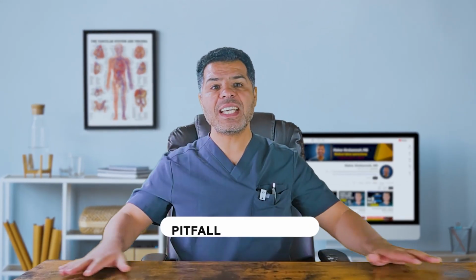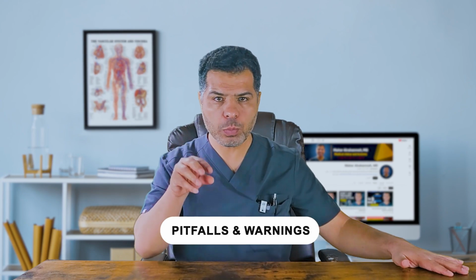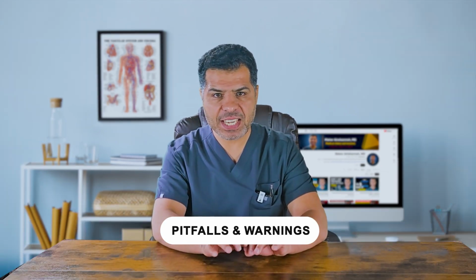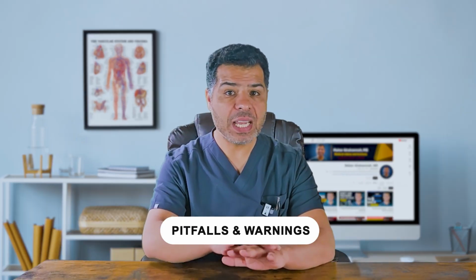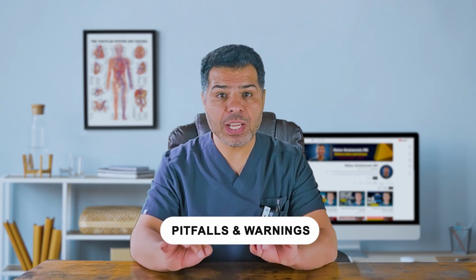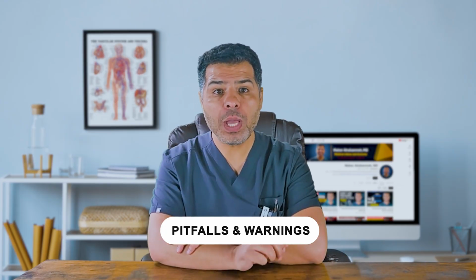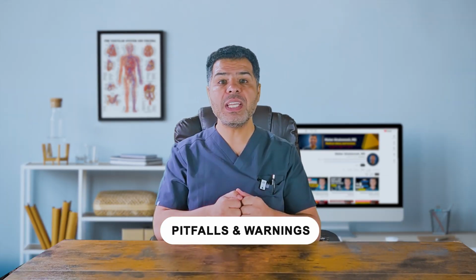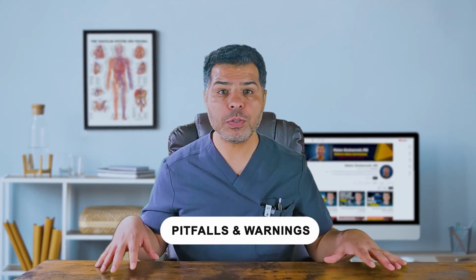Let's finish by discussing some pitfalls and warnings. Catheter-associated UTI is the most common hospital-acquired infection, and prevention is key here, as we said. Use Foleys only when necessary. Maintain a closed system, remove as soon as possible, and ensure proper hand hygiene. Do not break the closed system to get cultures unnecessarily. If you need a sample, use the sampling port with sterile technique. Never disconnect the tubing, please.